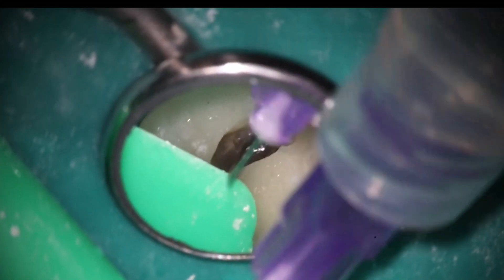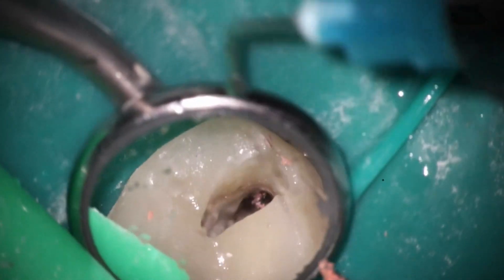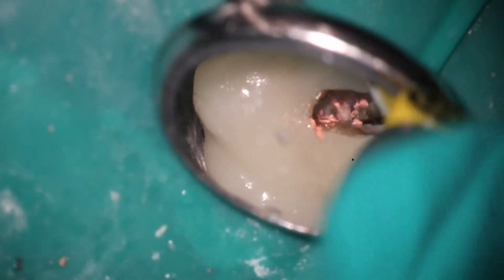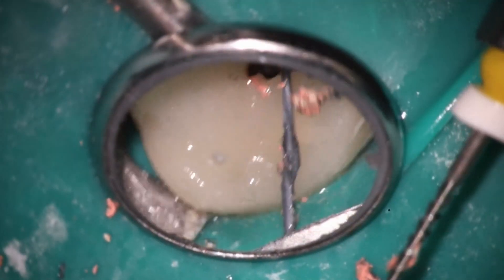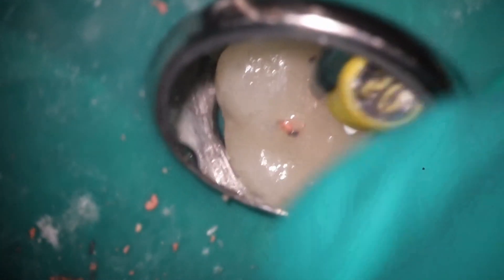I knew I was going to two-step this one. This is a true acute apical abscess case — poor guy was in a lot of pain and drove from about four hours away. But we got him all fixed up. So how do I get the rest of the carriers out? I use hedstroms on my file forcep holders because I can actually see where I'm placing them. Sometimes you can just get in and get lucky — I could see it was flipping around, so I was able to just grab that one and pull it right out.